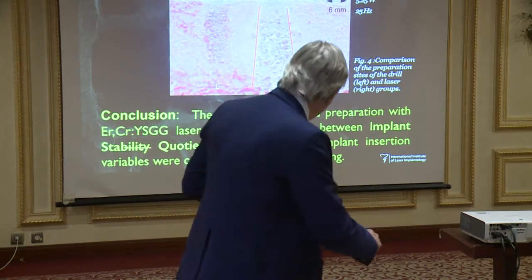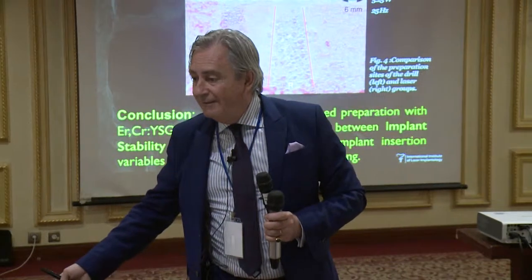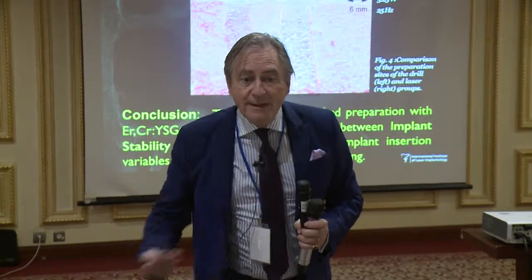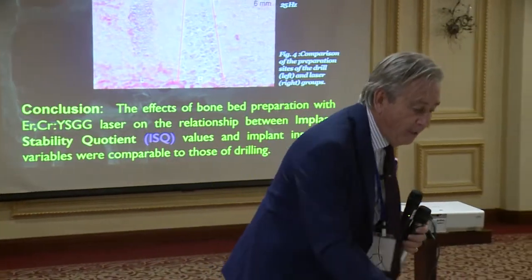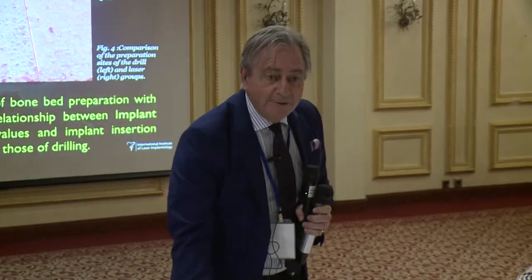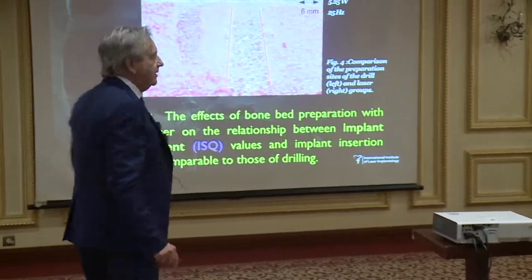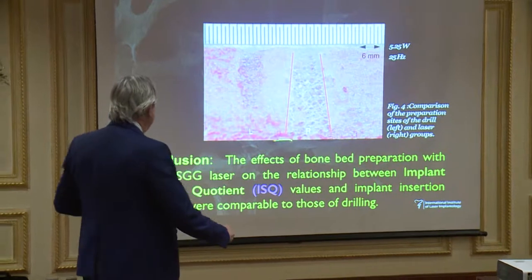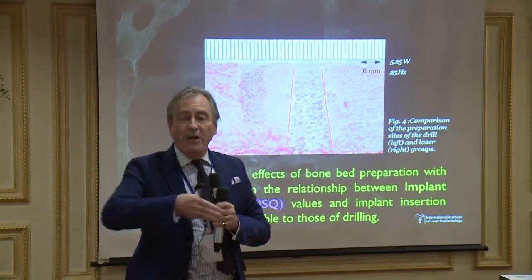So, you know, this was published in a peer-reviewed journal. But of course, these people didn't know about the use of laser. So how can you publish and make a comparison between devices that you don't know? Nevertheless, they ended up with the same ISQ, implant stability quotient, which is actually the translation of the primary stability.